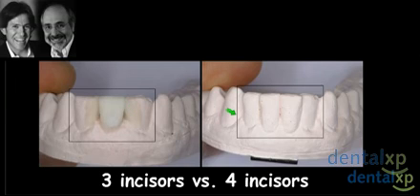The patient didn't really like these oversized teeth, so I wanted to know, could we replace 4 teeth? Not as crowded, but kind of as we had them before. So we looked at these options. I said, Maurice, we're going to put in 2 teeth. How are we going to do implants?